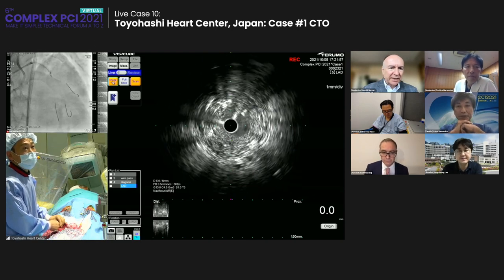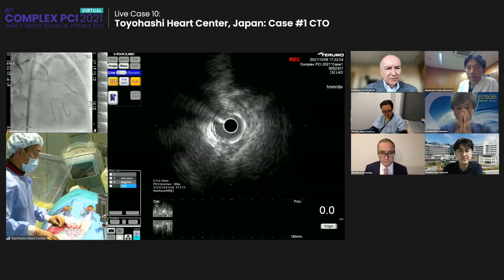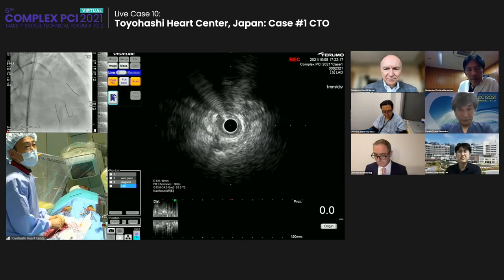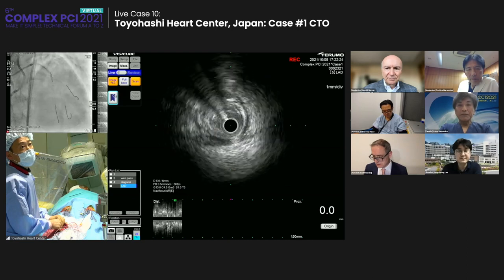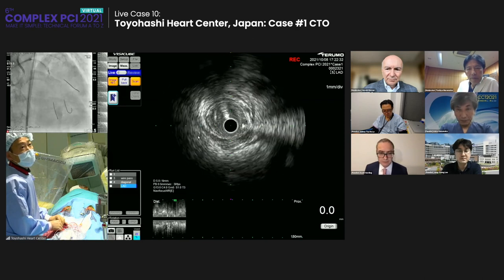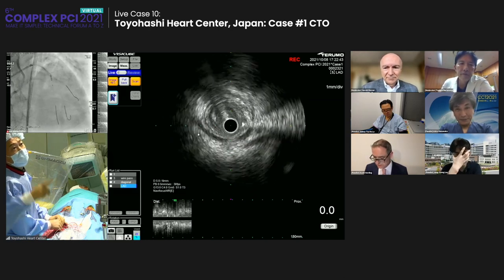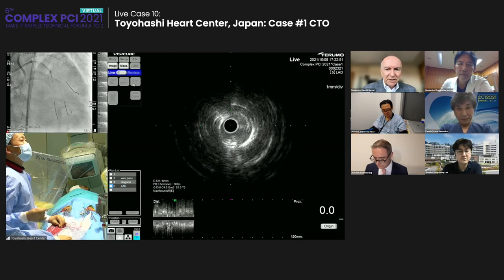I think you didn't do the distal LAD yet because you couldn't pass. Did you go further down the LAD to see where you need to land? Anyway, the vessel is shrinking, no plaque. No plaque, yes. Anyway, it may grow later, so we should cover all of the plaque so we can put the stent. Maybe the distal end of the remaining wire. Yes, this is a very good landmark, the distal end of the LAD stents. Probably around here is fine. We can surely place a 3 mm. Yes. Okay, and about the left main?